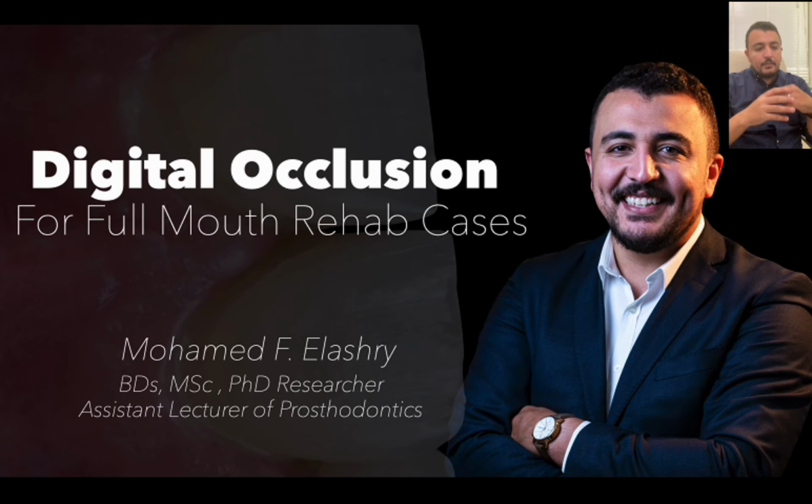So, thank you, Jenny, very much for this invitation for this webinar. I'm going to discuss today digital occlusion or occlusion recording for complete mouth rehabilitation cases and also for aesthetic rehabilitation cases, especially with implants.